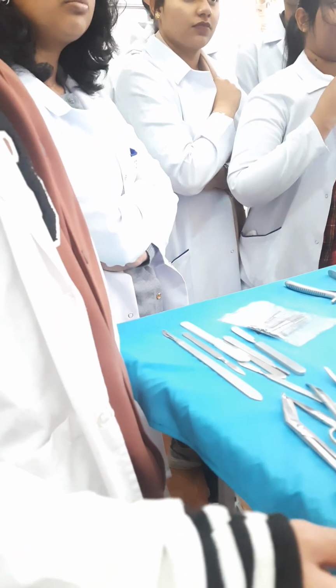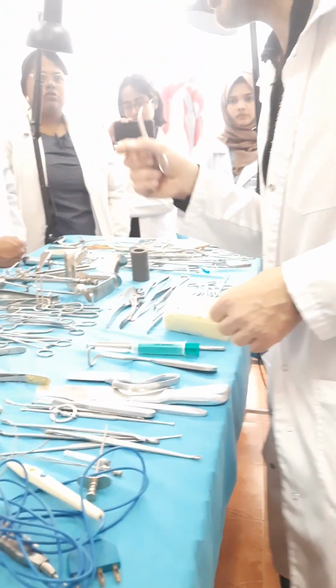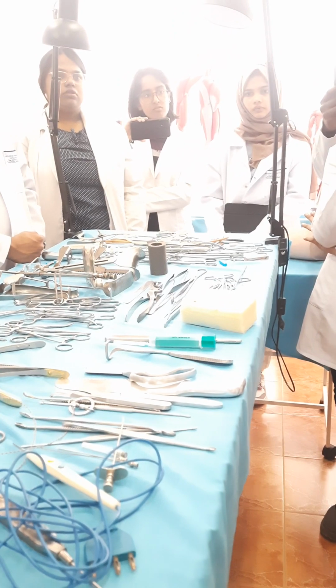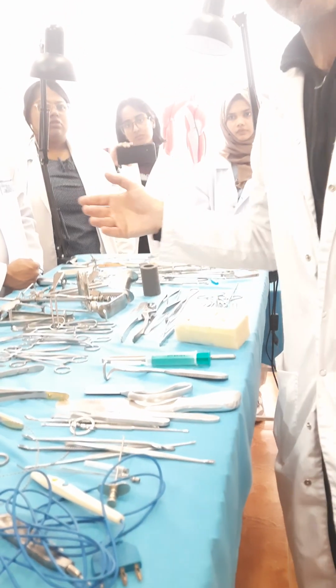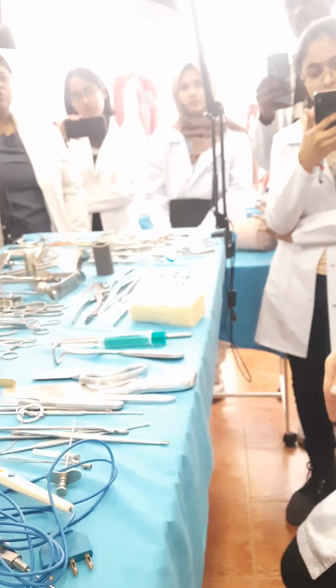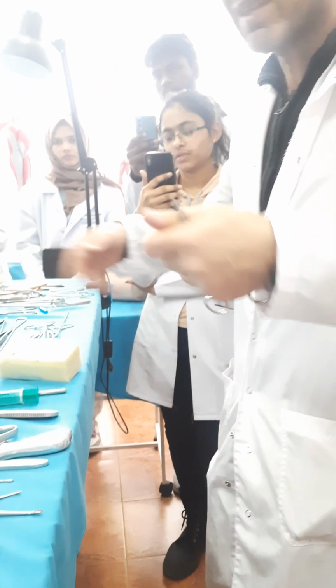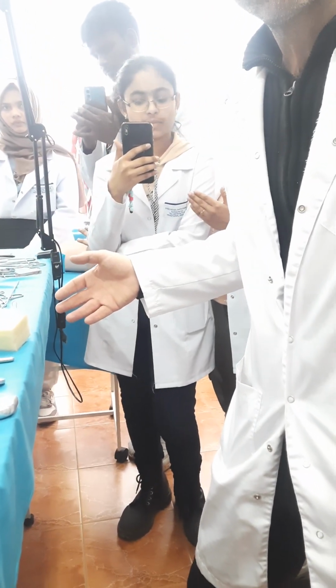Why here? A tourniquet can be applied only in the single bone region. Remember, please, I cannot apply the tourniquet in regions with double bones because the artery will go between them and the pressure will be impossible. That's why for the upper extremity it is the arm region, for the lower extremity it is the thigh region. Doesn't matter where the bleeding is, that is the place of tourniquet application.